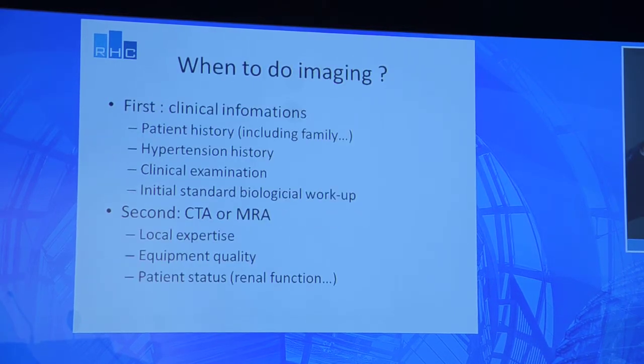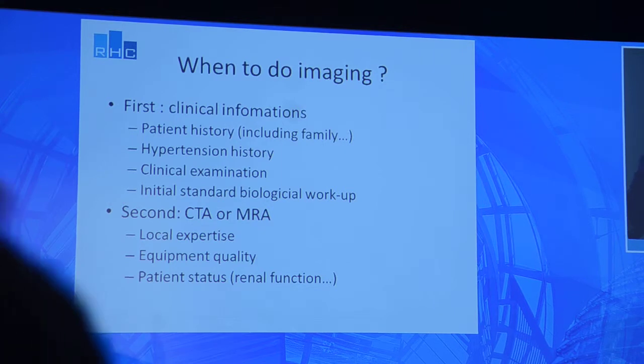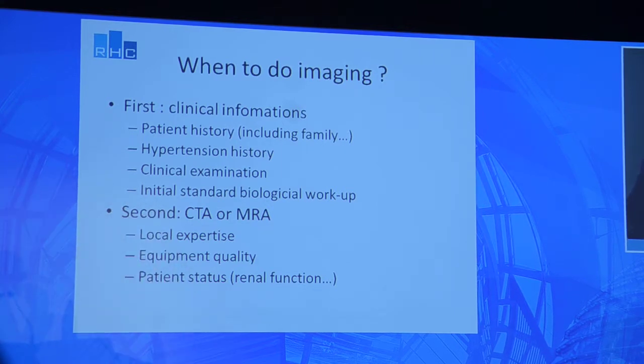So, of course, when we do imaging, whether we are a radiologist or clinical specialist, we focus on clinical information: patient history, hypertension history, clinical examination, and initial standard biological workup, because this will help you to address more appropriately the case of this patient.